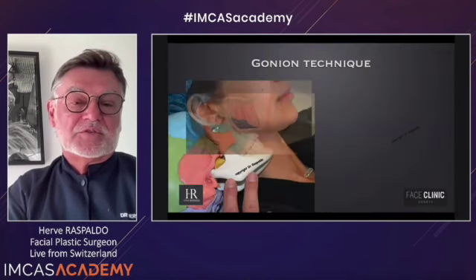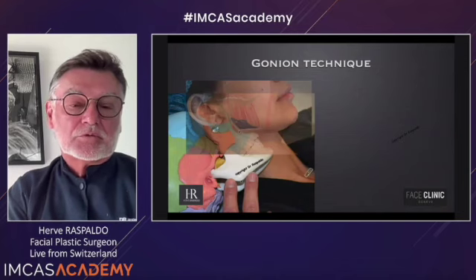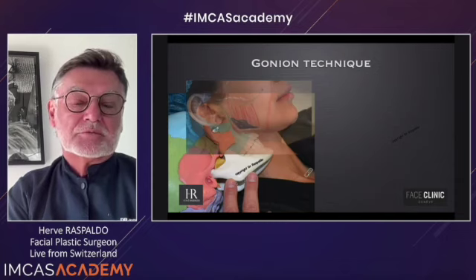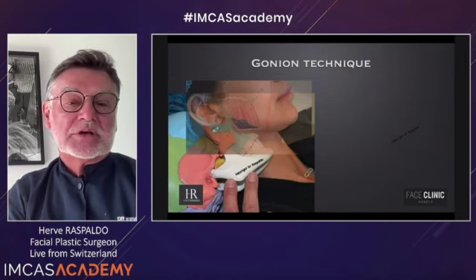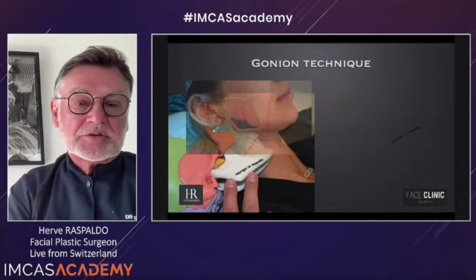So how to do it safely? We inject at the tip of the angle of the bone, right here. So there is no masseter here if you stay behind. And then this is a deep injection on the bone, and then you go more superficial under the skin to avoid the parotid gland laterally and lower, and more superficial than the masseter.